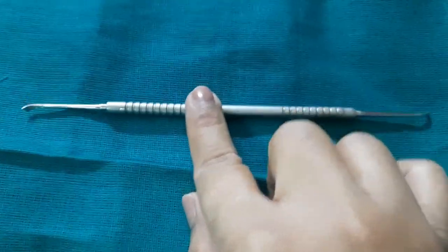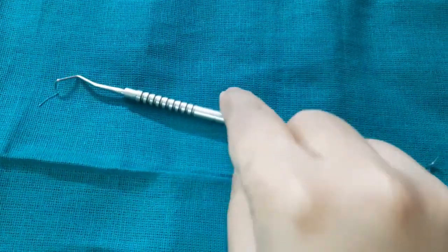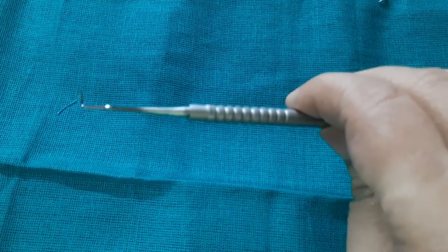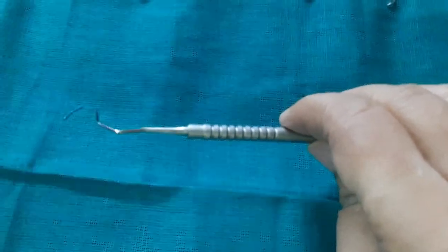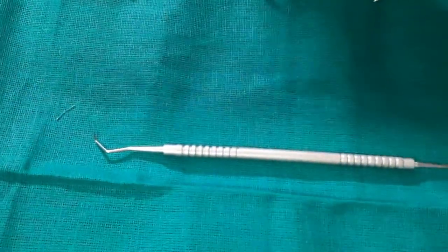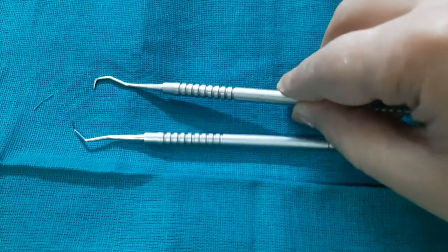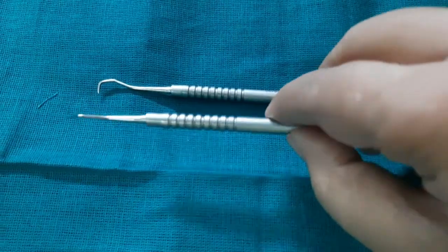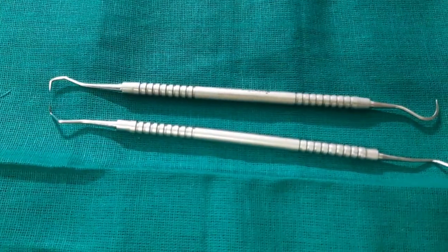The next one is a surface scalar — you can appreciate how flat it is. It is used on flat surfaces, basically to remove stains. It has a mesial end and a distal end. The last one is the posterior Jacquette scalar. You can appreciate how much angulation it has so that it can reach the posterior surfaces which are very hard to reach. You can see how it differs from the anterior Jacquette scalar — the anterior one is in only one plane, while the posterior one has more angulation.